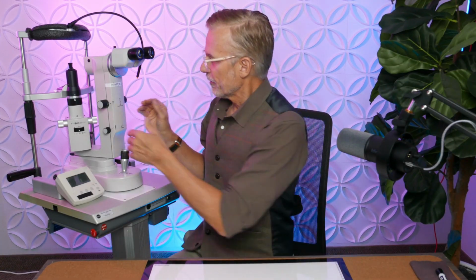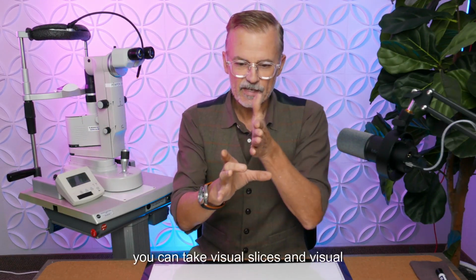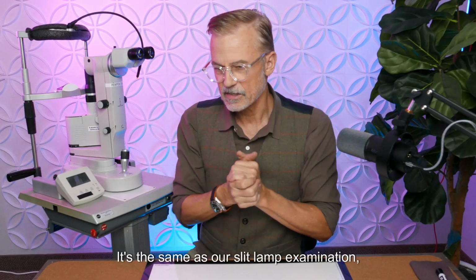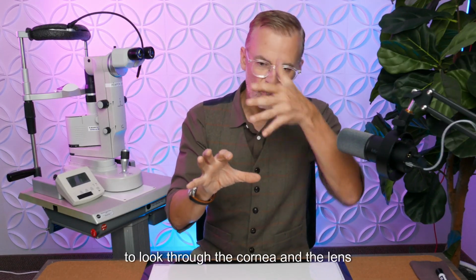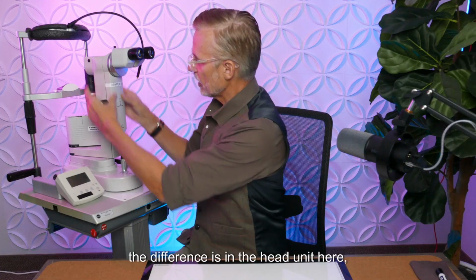So by moving that slit lamp from one side to the other, you can take visual slices and visual images of that dark space in there and give yourself a sense of that three-dimensional space. It's the same as our slit lamp examination, using a slice of light to look through the cornea and the lens and further back. So slit lamp design, the difference is in the head unit here, there is a laser.